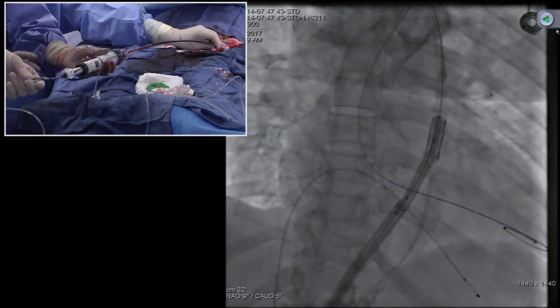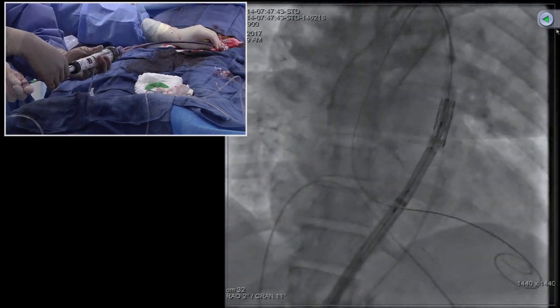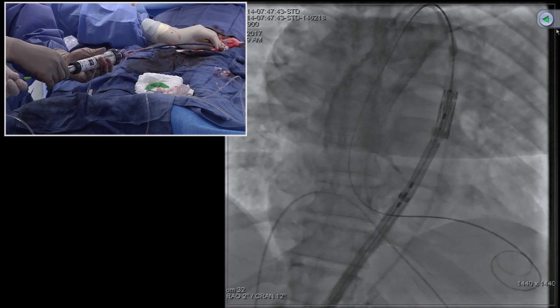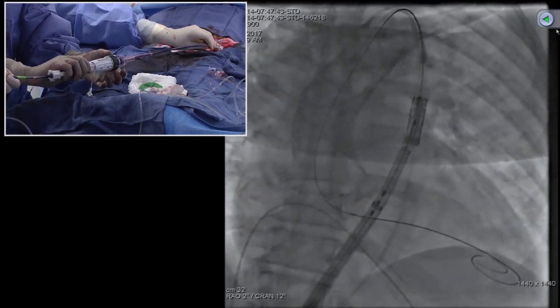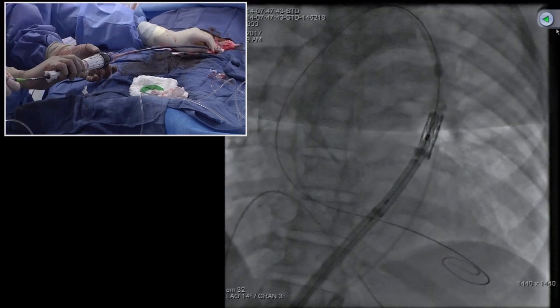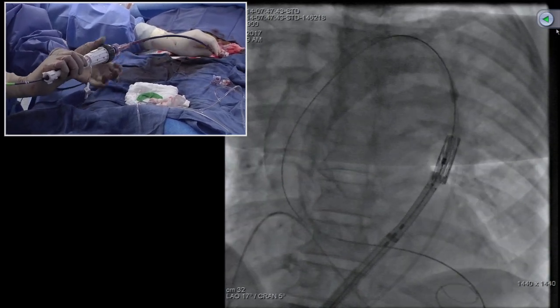Oh, so we don't have parallax, right? We have a little bit. Lock and lock, so if any kind of tension is released. And good. Now what I'm going to do, the key and most important part here, use the flex wheel, which is here. So I'm going to flex.